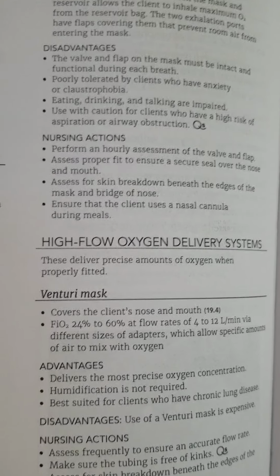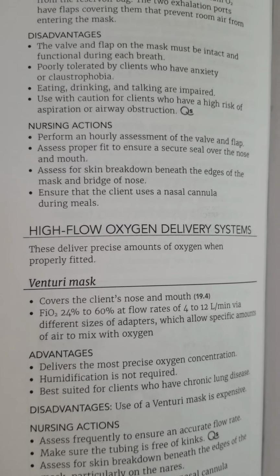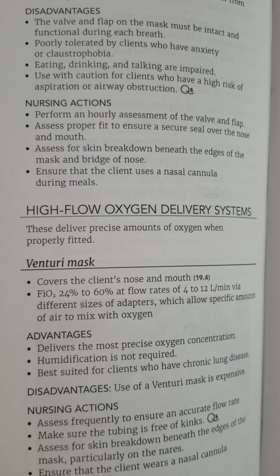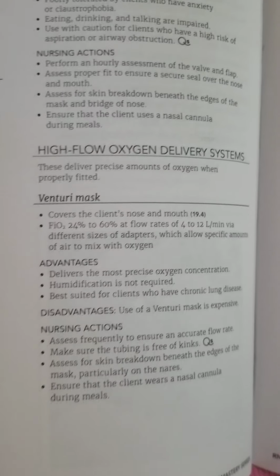Nursing actions are that you need to perform an hourly assessment of the valve and flap, assess proper fit to ensure a secure seal over the nose and mouth, assess for skin breakdown beneath the edges of the mask and bridge of the nose. Ensure that the client uses a nasal cannula during meals.